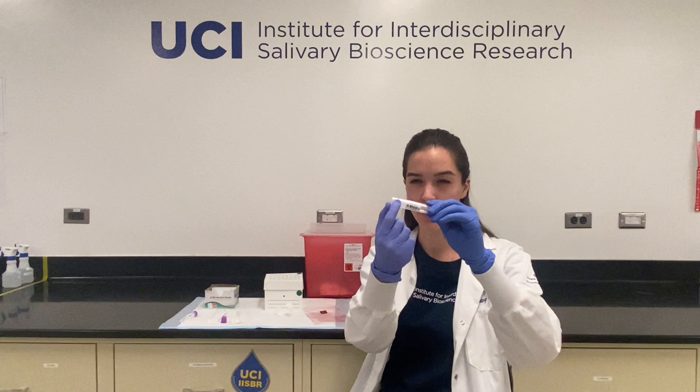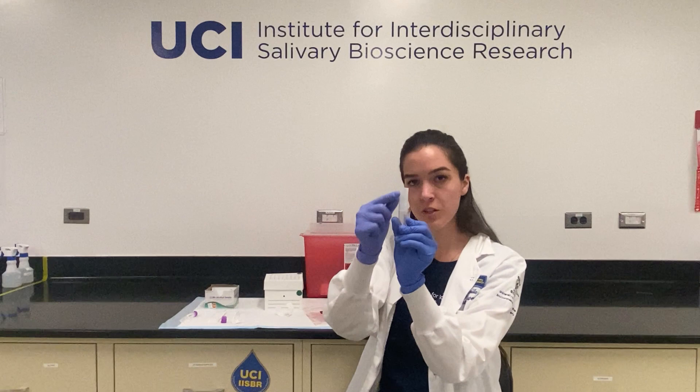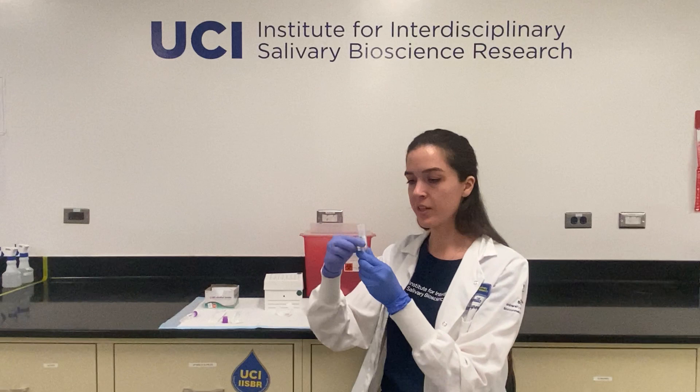For your collection today, you'll want to make sure that the basket is in the tube and that you're only taking off the cap. When you're ready to collect, you'll take your tube and then take your swab.